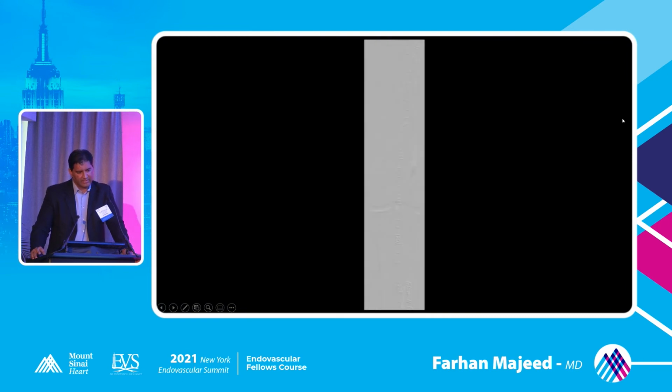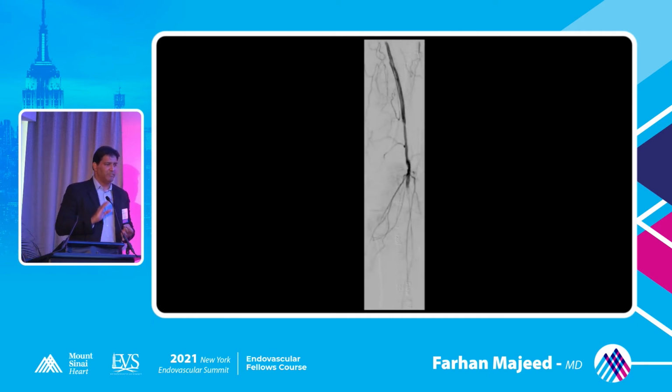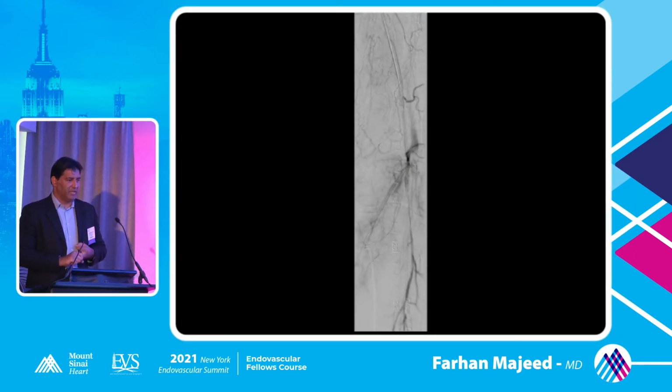So we got that. So now what are we seeing? This is an important part. So we've done 3 therapies. We've done angiojet, we have done laser, and we've done PTA. So what's going on here?